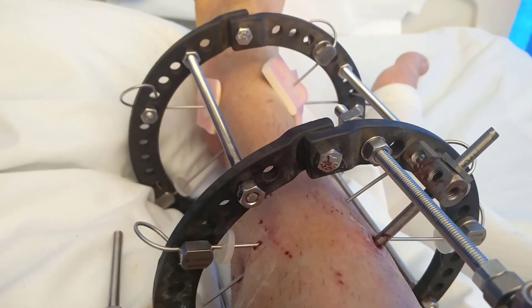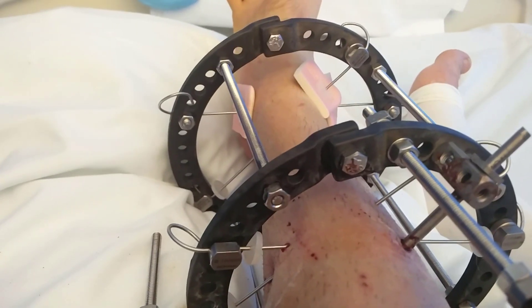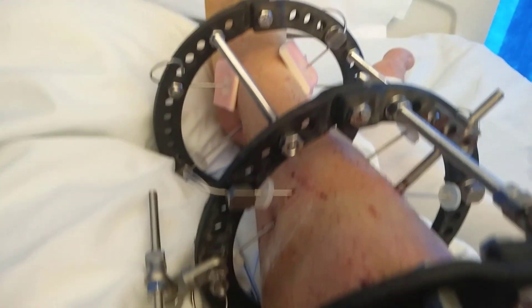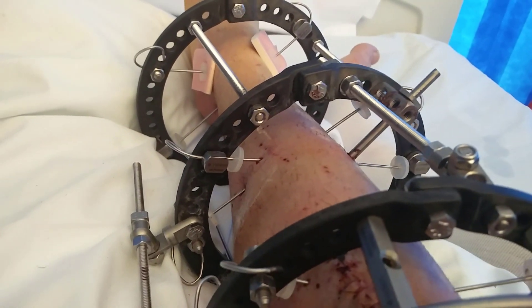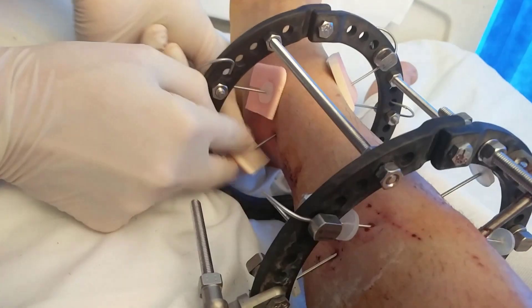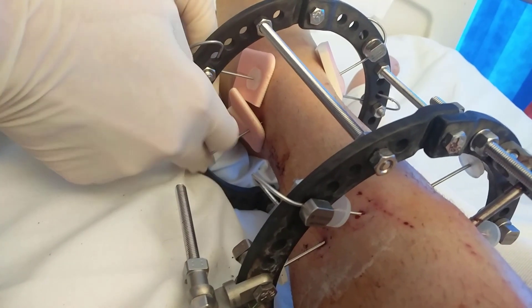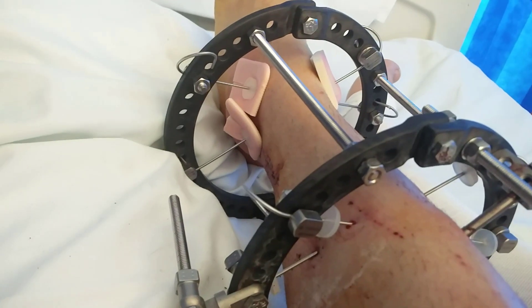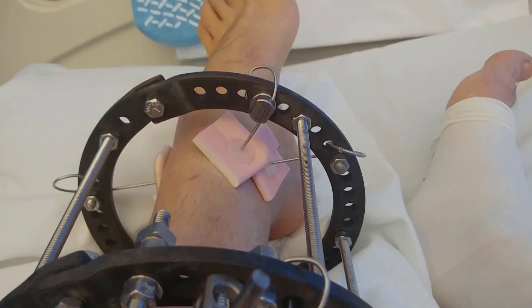The dressings actually soak up a lot of anything that oozes out from your pins. They're not sticky so they don't stick to you. They behave quite well with the pins, and they let air get to the wounds, which helps it all dry up.